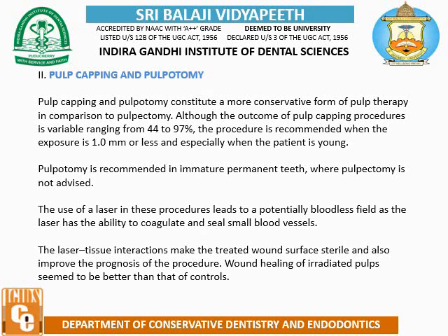The use of laser in these procedures leads to a potentially bloodless field, as the laser has an ability to coagulate and seal small blood vessels. The laser tissue interaction makes the treated wound surface sterile and also improves the prognosis of the procedure. Wound healing of the irradiated pulps seems to be better than that of controls.